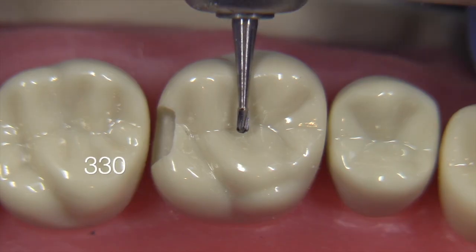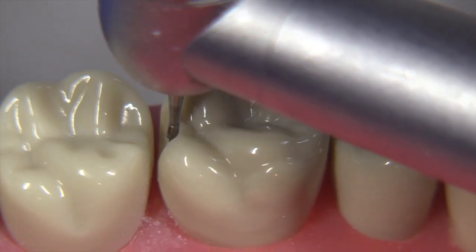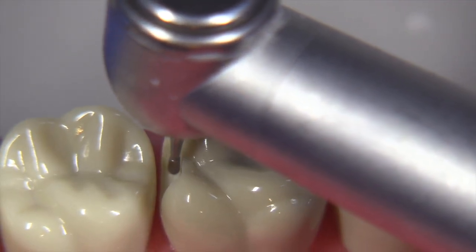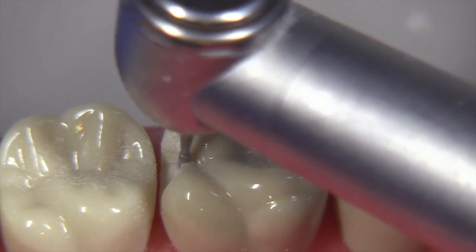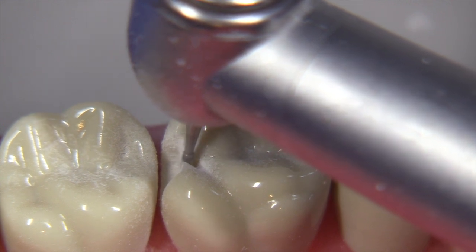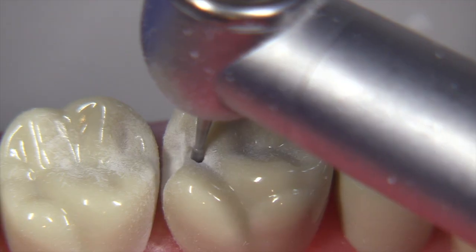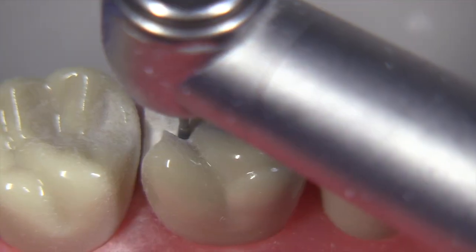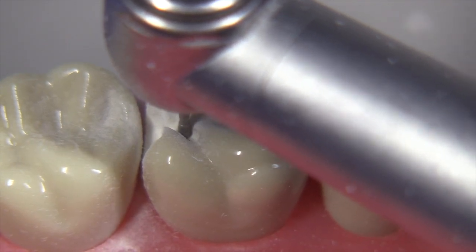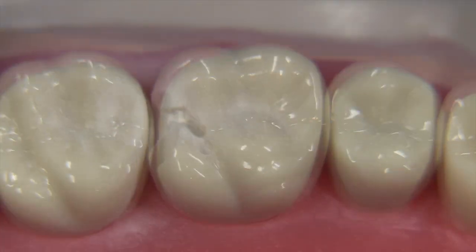Now we switch over to the 330 bur and we're going to start by not making a punch cut, but by sliding into the preparation from the box. This is a really useful way to do it because you know exactly what your depth is and you don't worry about punch cutting too deep or creating some other type of error. We can then extend this further into the distal lingual groove to obtain that additional one millimeter extension into that groove.